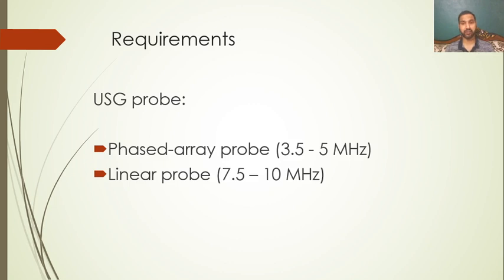The frequency of these probes is very important because the lower the frequency, the more is the penetration and the depth, the deeper organs you can see. The higher the frequency, the more superficial the structures you will be able to see.